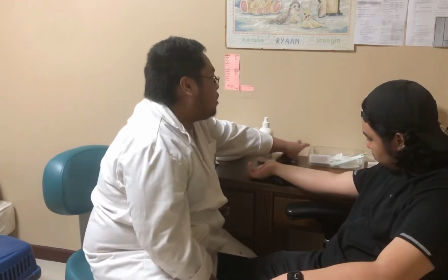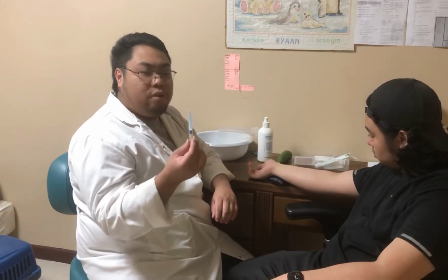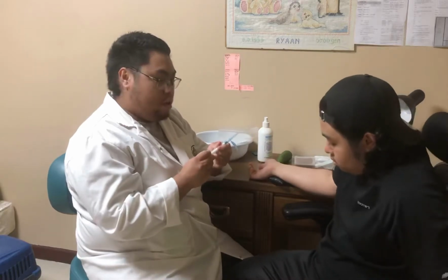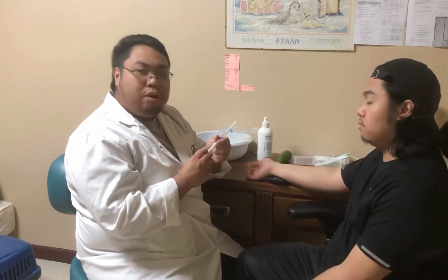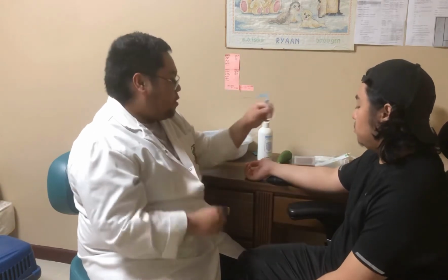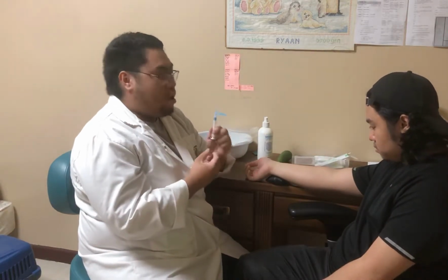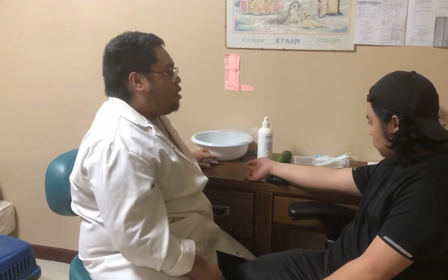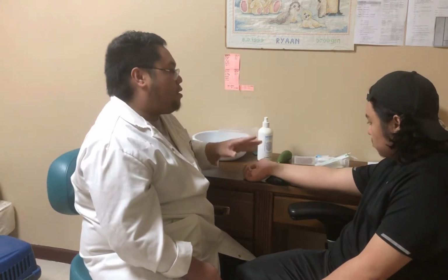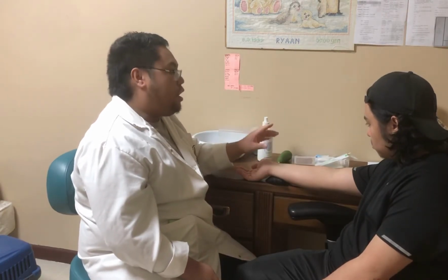So the next step is to heparinize the needle and the syringe. But this one is already pre-heparinized, so we're just going to prime it in order to make sure that the heparin solution is mixed well. Also, eject all the bubbles because the air inside might alter the result. So now we're going to prepare the site and the fingers used to palpate the site by cleansing it with iodine and alcohol.